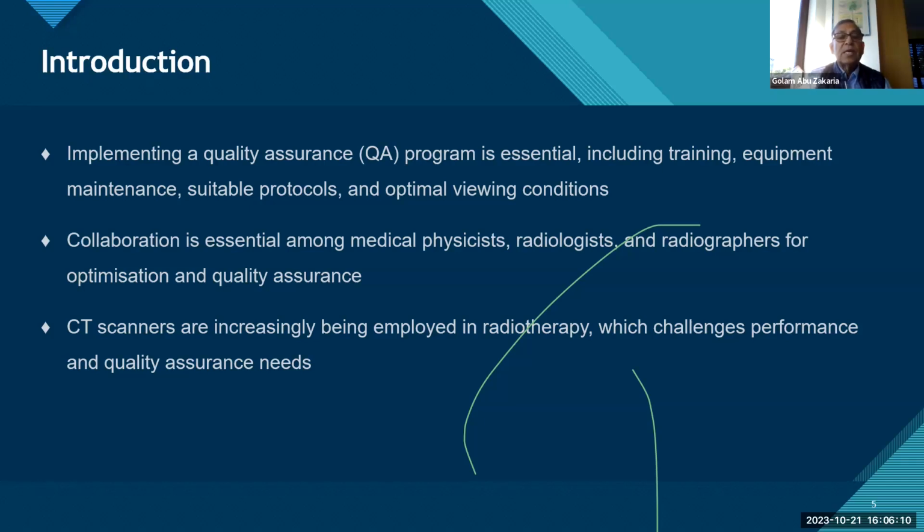I told you, CT is actually the most important tool in radiotherapy treatment planning. Without CT, there is no treatment planning. In earlier times, the medical doctors had some radiology photos and did two-dimensional treatment, so we could not spare the organs at risk, and this was actually not correct planning. And since the invention of CT, the medical physicist can do a very exact plan.